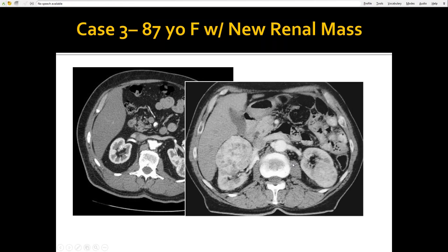So, you just got to have a conversation. This tumor over here, you could potentially treat. One thing I've done is actually gone in and embolized this tumor that's fairly big with ethanol into the artery itself, and then go back and actually do a chemoembolization, or a thermal ablation, like a cryoablation. So it shrinks the tumor to get it into a decent size and then go back and treat. This tumor is pretty much too big, so your best option would probably be, again, to just embolize this segment of the kidney, and maybe the surgeon would take it out.